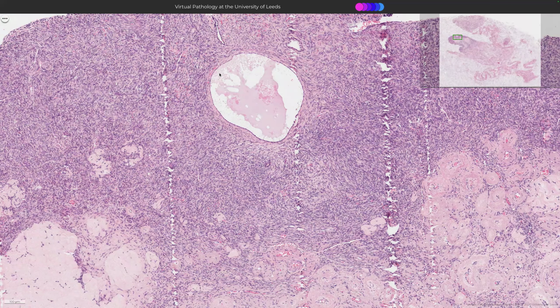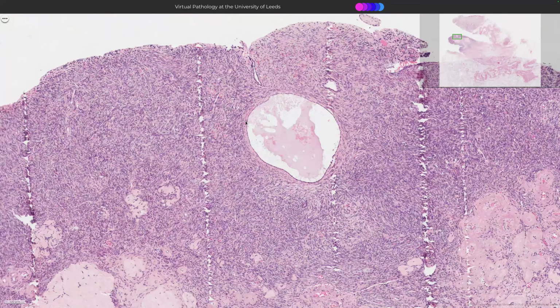Yes, a cortical inclusion cyst. So if I stained this, what would it be lined by? Do you think it would be calretinin positive, like mesothelioma, or PAX8 positive, like ovarian stuff? They're mesothelial derived for sure.